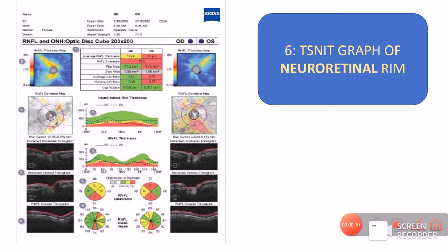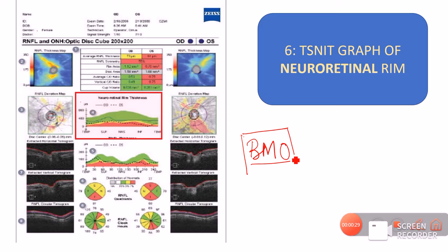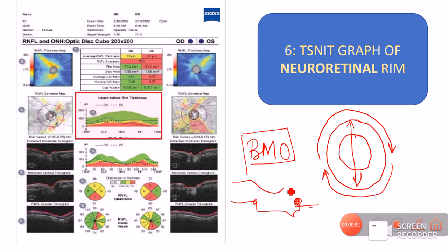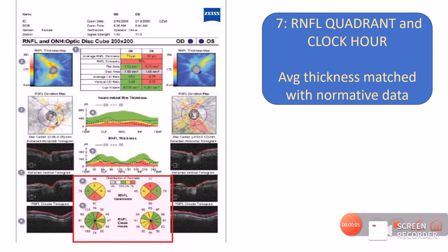In this patient, the TSNIT map shows the dotted line dipping into the red zone in the nasal and inferior part of the peripapillary RNFL representation, consistent with the abnormal RNFL deviation map. Very similar to the TSNIT graph of RNFL thickness, we also have a TSNIT graph of the neuro-retinal rim, which measures the thickness of the NRR along the Bruch's membrane opening. The difference is that RNFL thickness is measured at a 3.45 mm circle around the disc, while neuro-retinal rim thickness is measured from the Bruch's membrane opening to the internal limiting membrane.